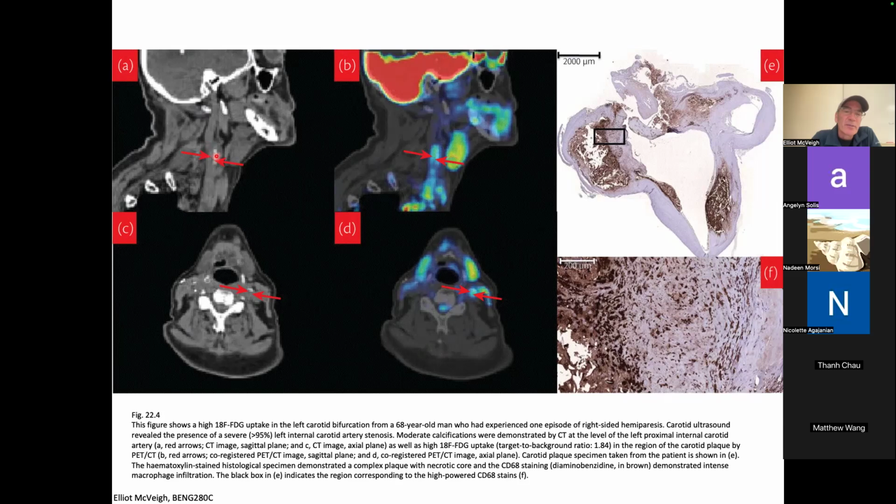So here there looks like some kind of calcification, and there's a slight stenosis, although I'm not an expert at reading these things at all. You do know you have one on each side, right? You've got one over here and one over here. This points to, I think, a piece of calcium beside the vessel.